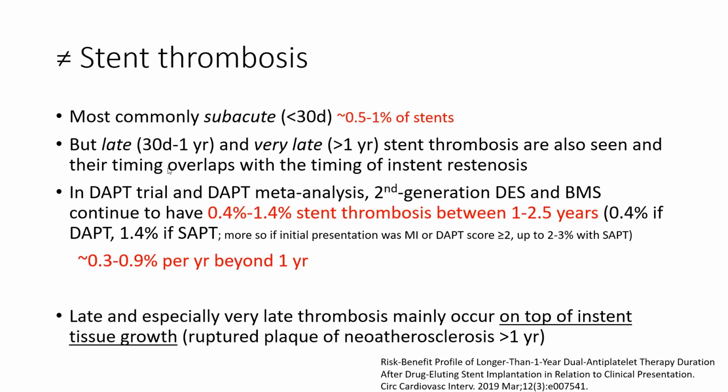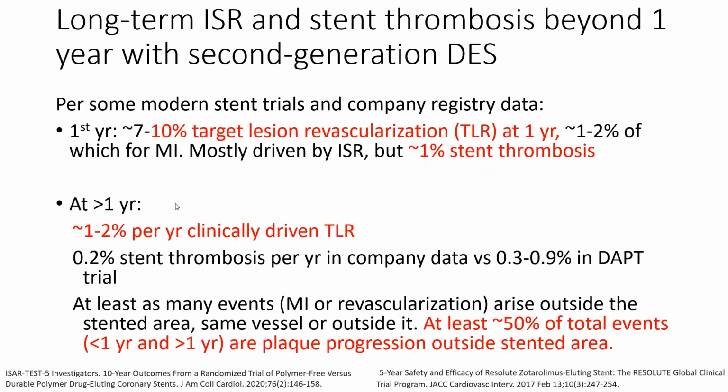That's why stent thrombosis and stent restenosis can have a lot of overlap, and IVUS will help you figure that out. You need to know those numbers. I will give you the numbers, to sum up all those mechanisms. Okay, well, what's the frequency of all those mechanisms I just described?